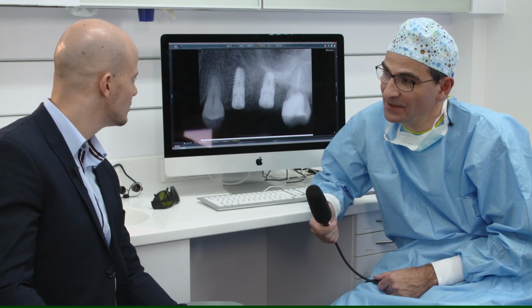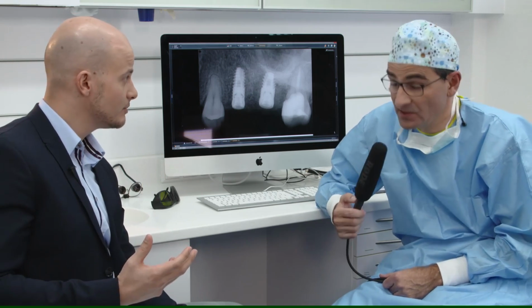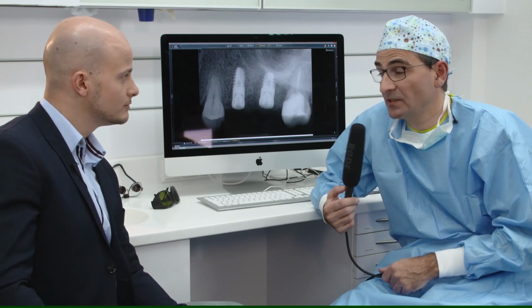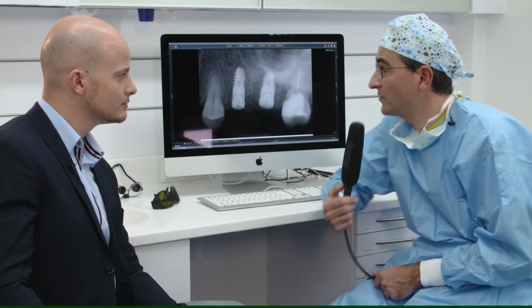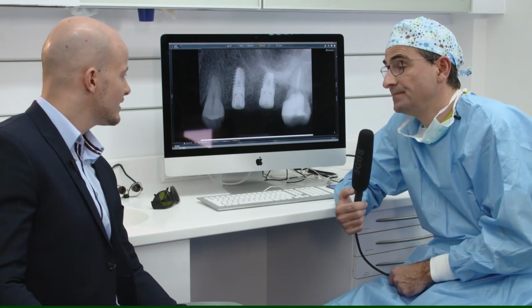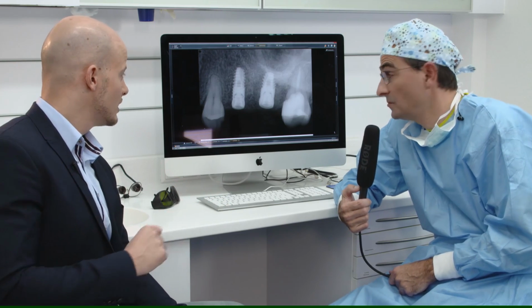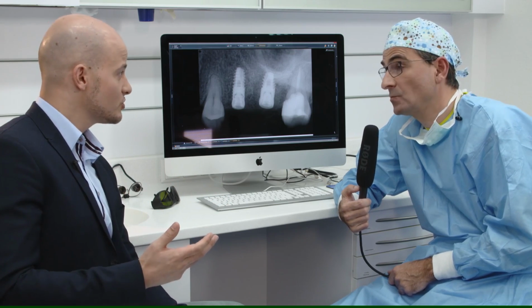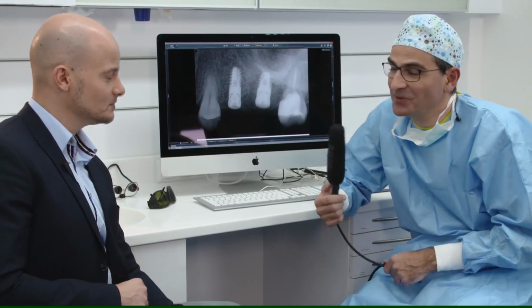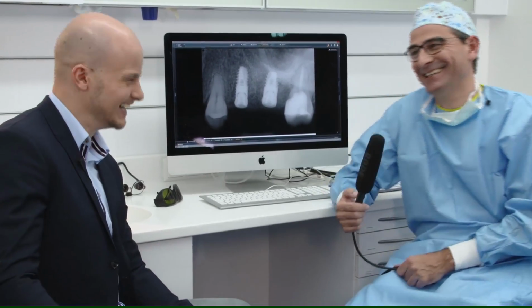Okay, good. So in this case, you could avoid a bigger surgery by planning backward? Definitely, because you see everything in a three-dimensional way. You see exactly if there's enough space for the implant. So when I see this picture, it's really great because it's exactly like you planned it in advance. Yes, and I think it was a perfect operation. Congratulations. Thank you very much. I would say it's a little bit of daily routine if you're using this. That's true. I know, Frank, you also have to do this in the future.